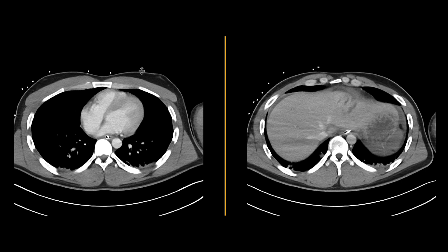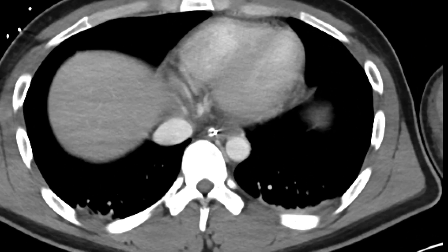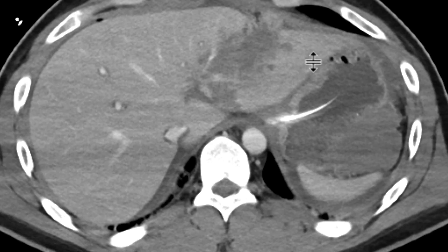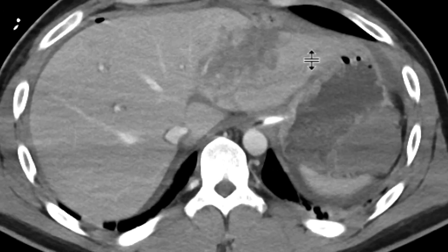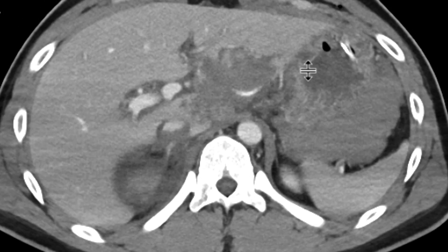This is a patient who comes in with a gunshot wound injury, and a CT scan was obtained to evaluate the extent of the patient's injuries. You can see that there's extensive injury in the left hepatic lobe with a large laceration.